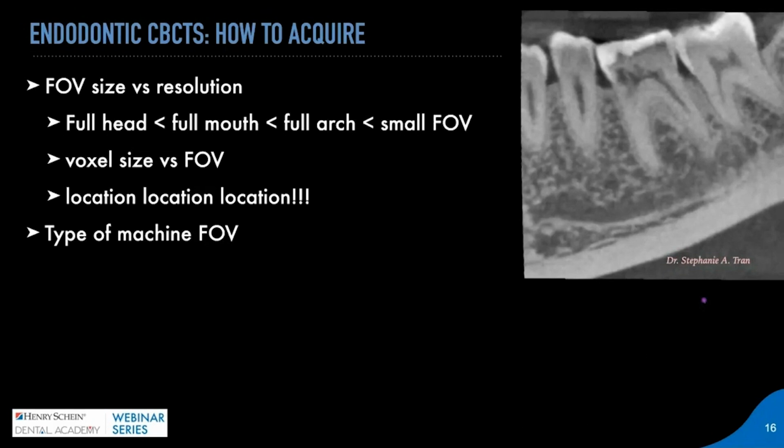So how do you even take a good CBCT for endodontics? Ideally, it's all about the field of view, because with endodontic treatment, we're dealing with much smaller structures. So unlike ortho, unlike surgery, we're not looking at the broad aspects of the bone. We want to look at super fine detail aspects of the tooth, the canals, and even within the PDL itself. So we're talking about microns. We're talking about under 100 microns preferably. So that requires a limited field of view. We want to keep in mind that the field of view is inversely related to the resolution.